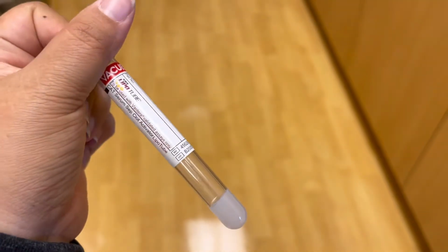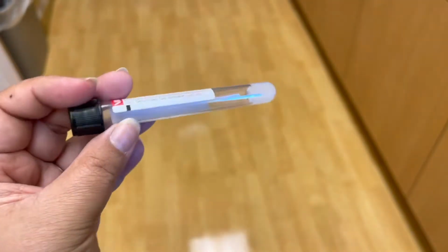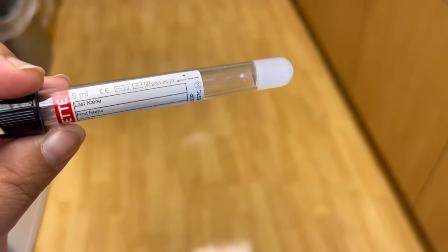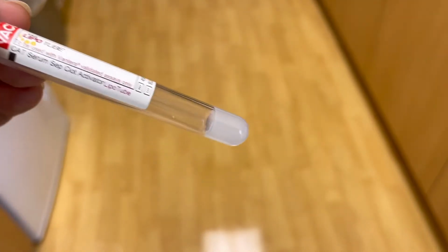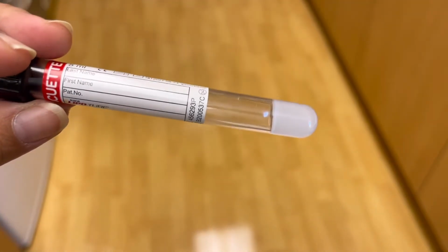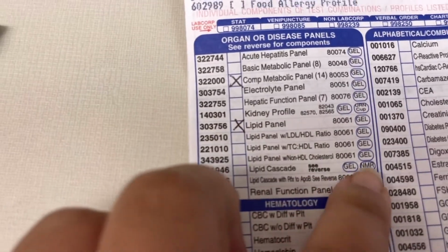So here's the NMR lipo tube. I call it the bumblebee tube because it's black and yellow. And this is a special kind of cholesterol test here. So there's this gel right here. And yeah, this is where NMR testing goes. So like I said, it'll tell you right here, NMR.